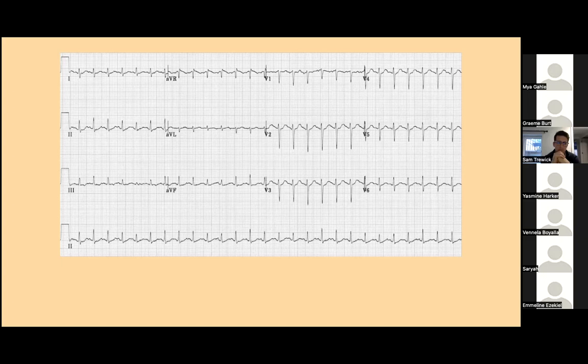27 times 6 is a little bit fast, and then you could just check how many you can times by, and so on. So I'd usually use a calculator, but it's a little bit tachycardic, I guess, first of all. Then I look at, is it regular? It looks pretty regular. And then, are there P waves?